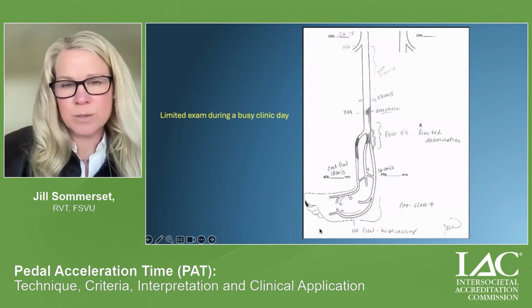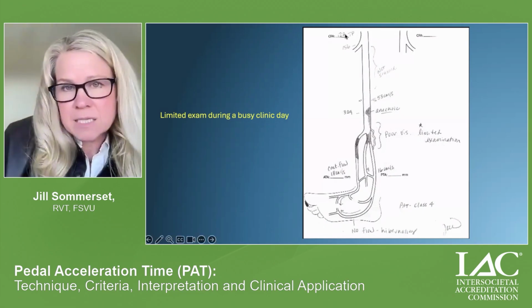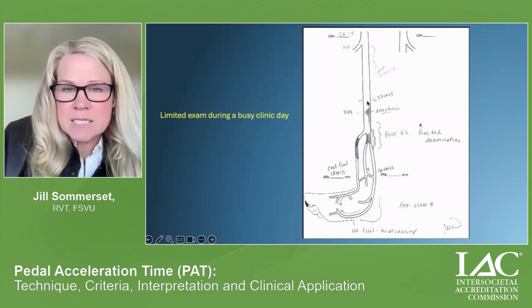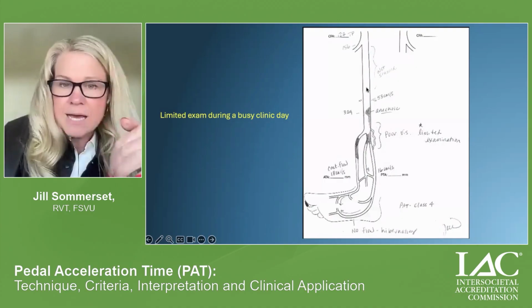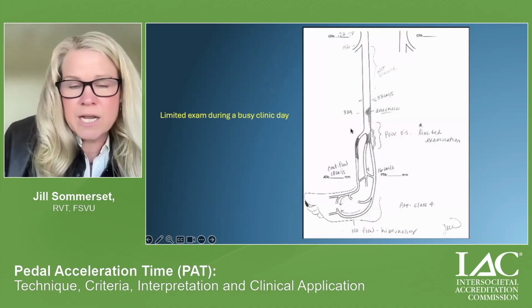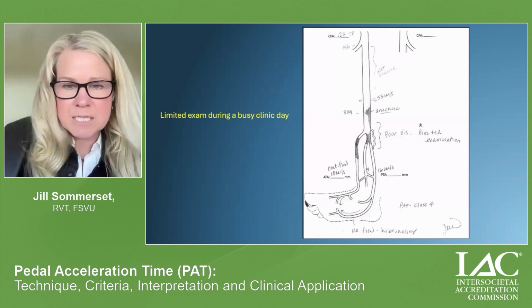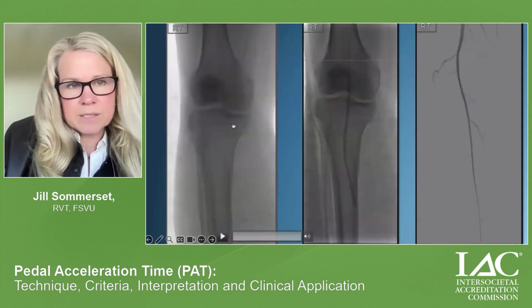We know that Dr. Tesso is going to intervene and he needs to know, triangulate the disease. He's got a multiphasic common femoral artery and distal pop is also stenotic. So he could do antegrade access safely to do his intervention. And there's significant disease in that tibial peroneal trunk, ATPT peroneal region. Let me fast forward here to the case.